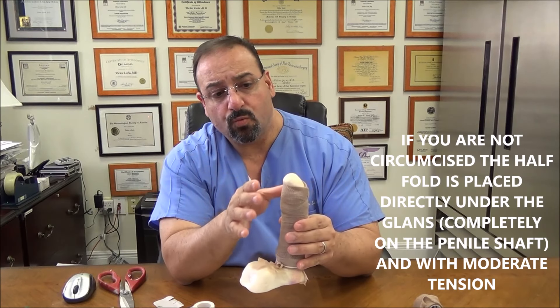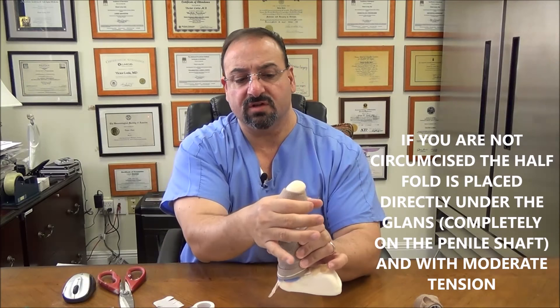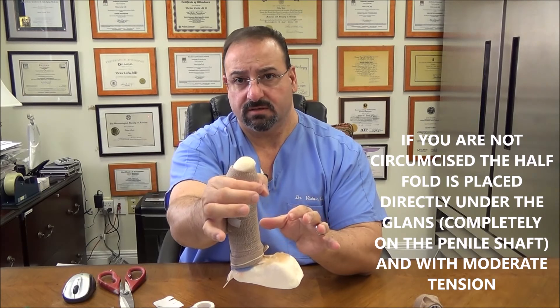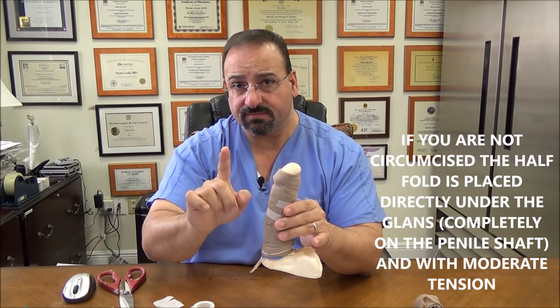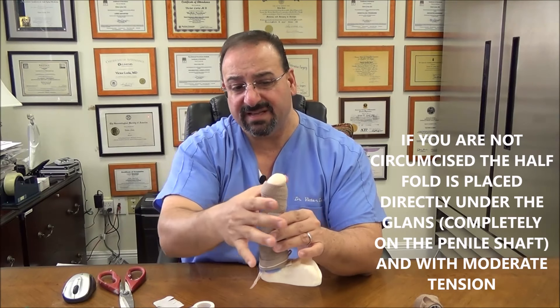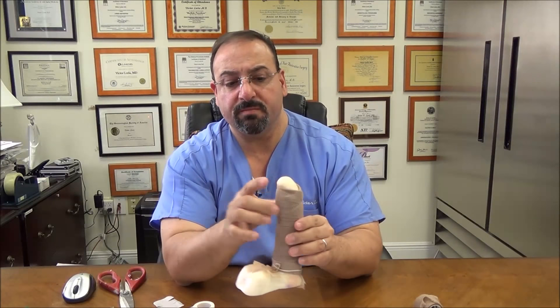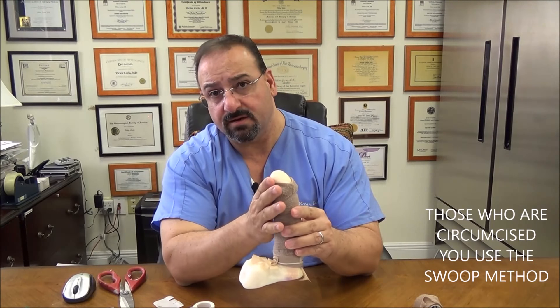If you're not circumcised, what we do is put the half fold underneath the glans entirely with moderate tension — that's only for those who are not circumcised, because the foreskin drops down and we need to keep it in place with pressure. That's different. For everyone else you do the swoop method where you swoop down like demonstrated.